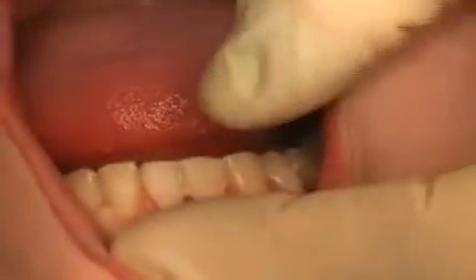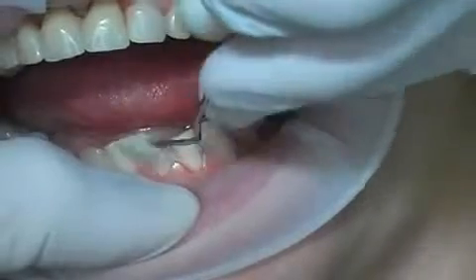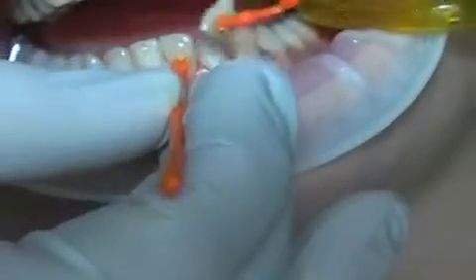Now you only need to choose the color before the order is sent to the technician, who needs approximately 1 week to manufacture the actual veneers. After a week has passed, the plastic provisional solution is removed and the teeth are cleaned with a brush. Veneer fitting is followed by the gluing procedure.